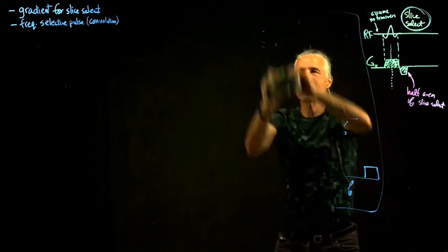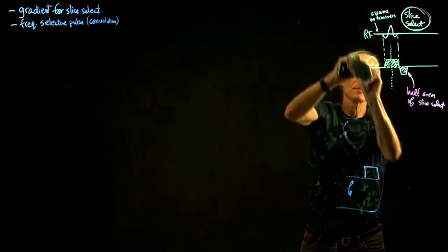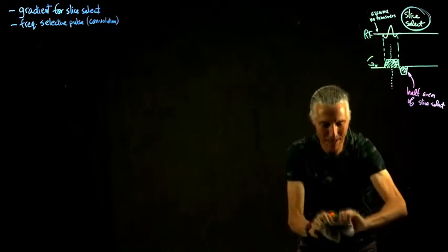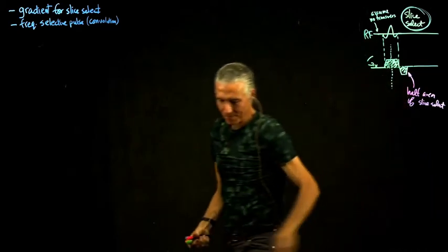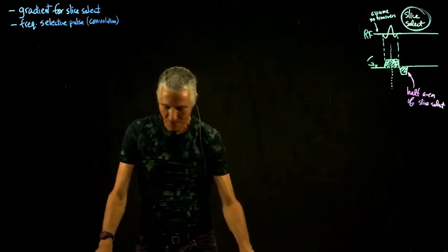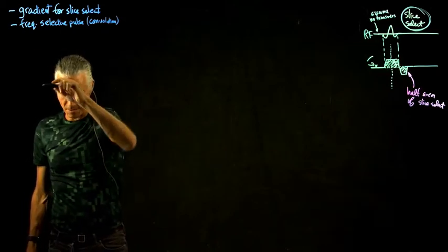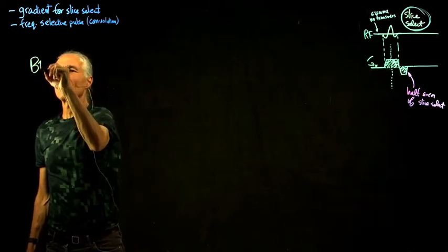it's the Fourier method. So I'll leave the gradient pulse up there for the time being. So it uses the Fourier transform once again. So let's write that. So this is first of three equations total. Okay, so here's the B1 field.